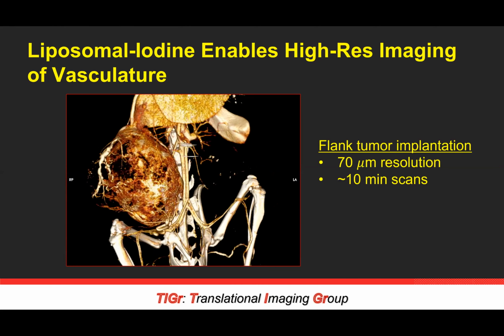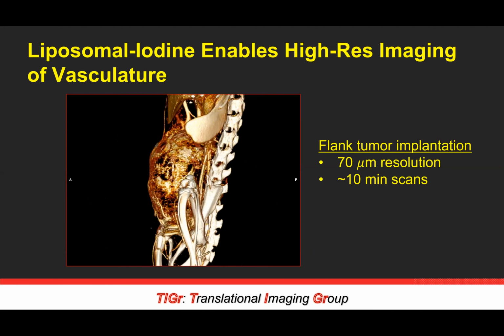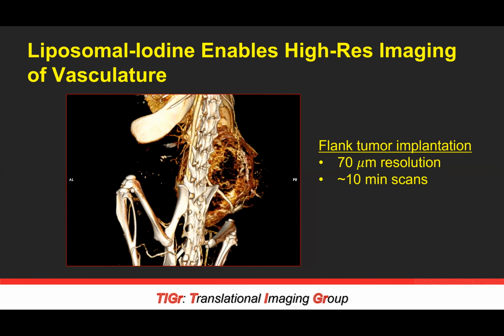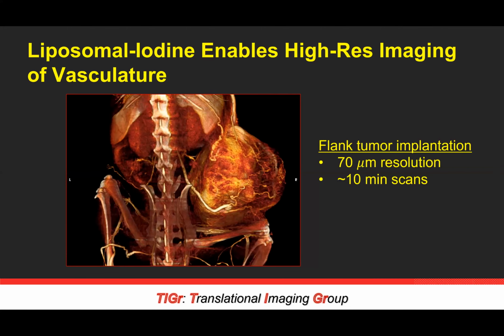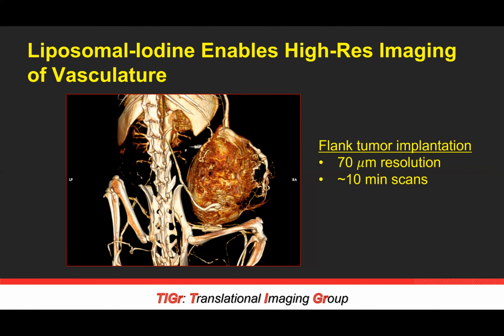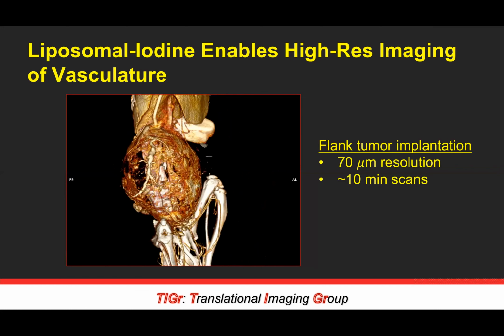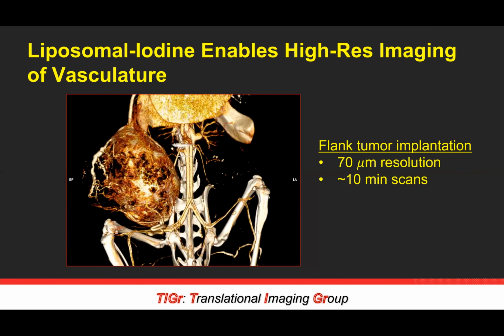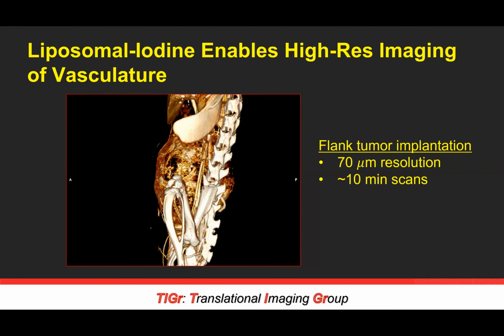And we had a question about the program that we're using for this. This is OsiriX. This is a software that's used for Mac that you can download with a license. There's a free version of it called Horos, actually, which is really valuable and I use pretty frequently. It has some features that OsiriX doesn't have, but it's still very valuable for being able to get these fly-through images that you've seen throughout this presentation.